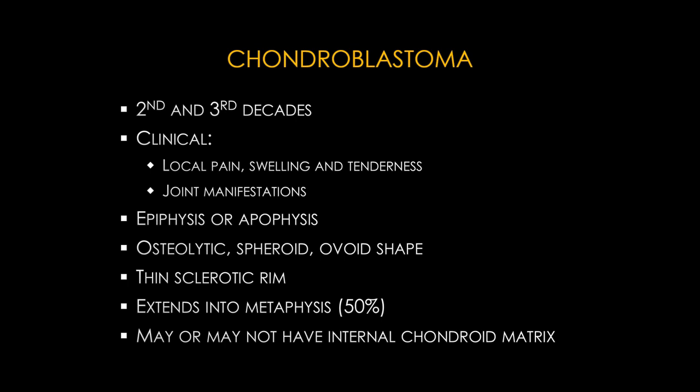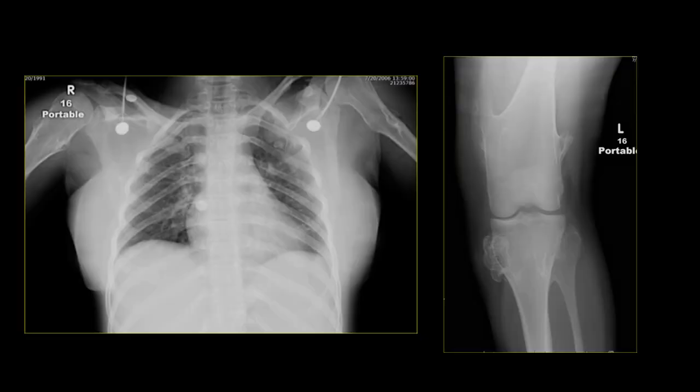On AP views of the chest and left knee we see multiple lesions arising from the distal femur, proximal tibia, proximal fibula, and bilateral proximal humerus — these are multiple osteochondromas. Osteochondromas are fairly common, usually solitary. The imaging hallmark is an exophytic lesion arising from the metaphysis with continuation of the medullary cavity and cortex into the lesion. They classically arise from the metaphysis and extend away from the articulation and can be pedunculated or sessile.